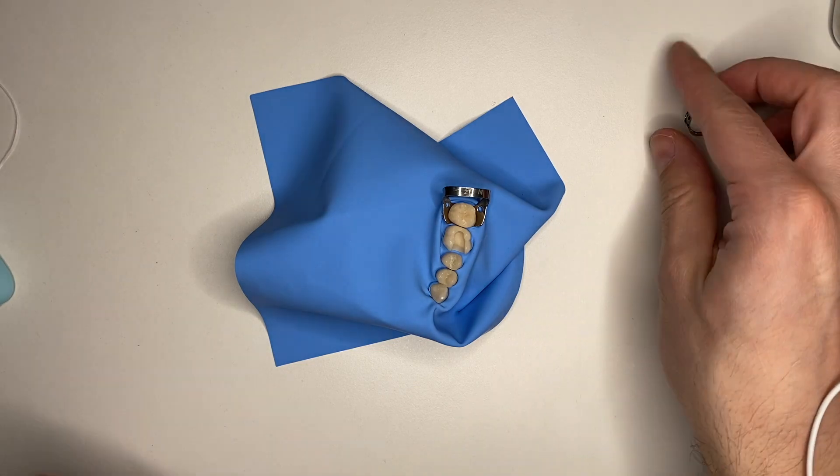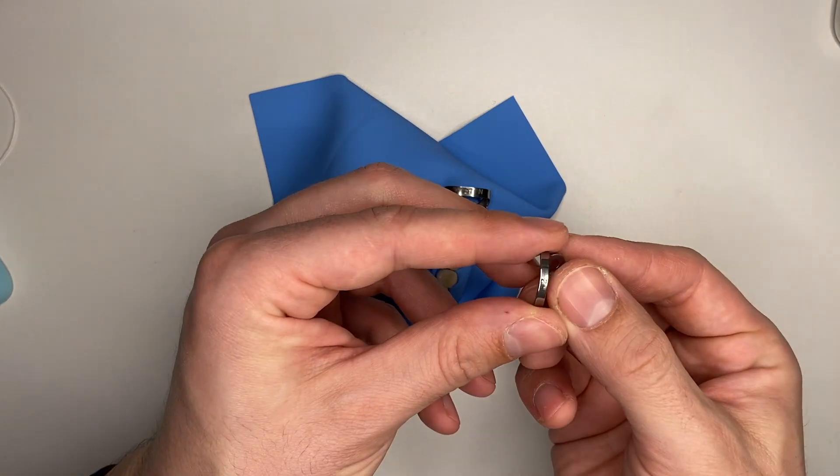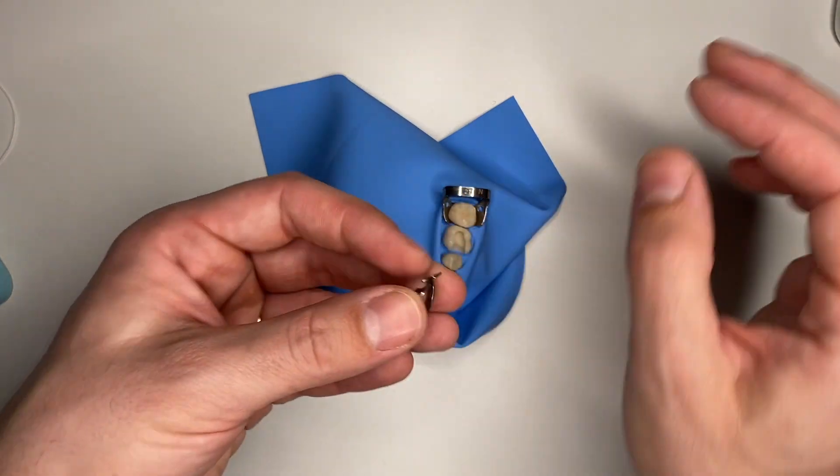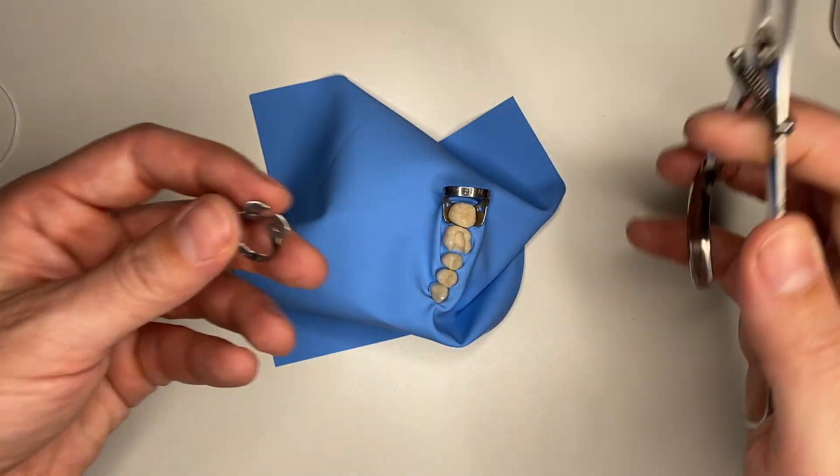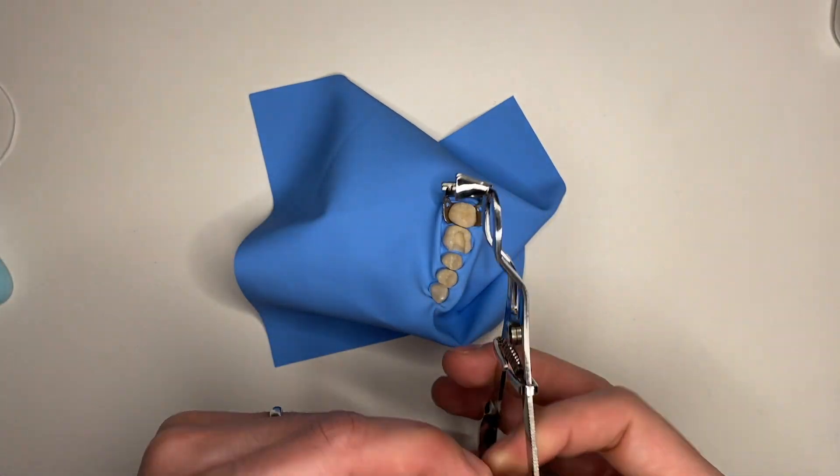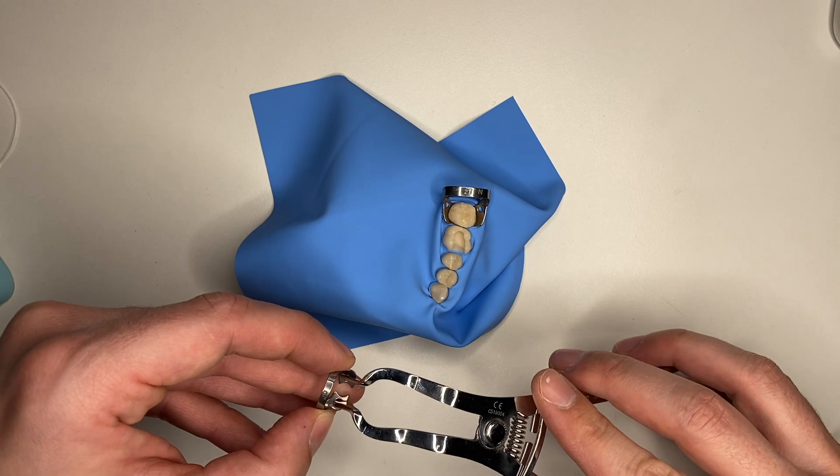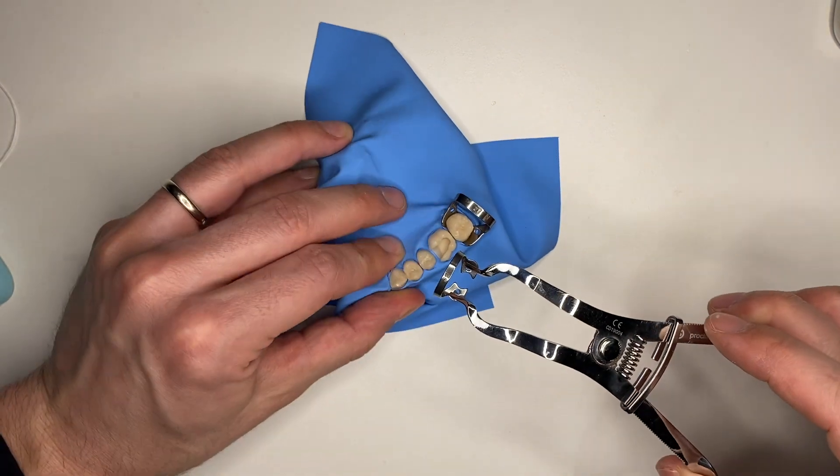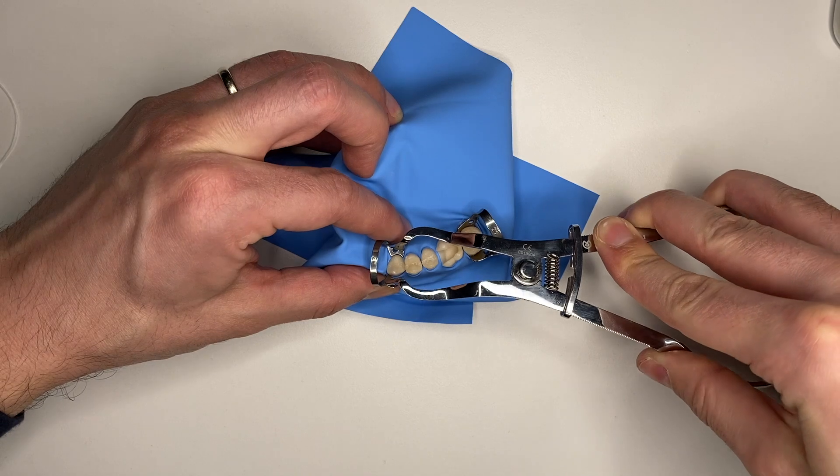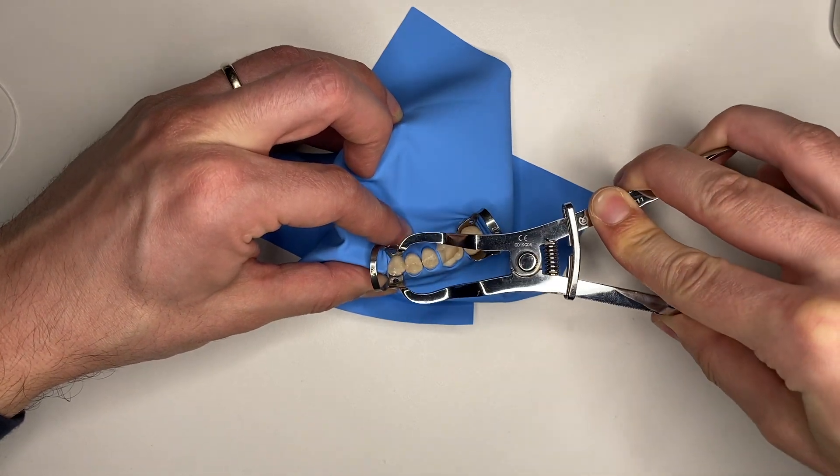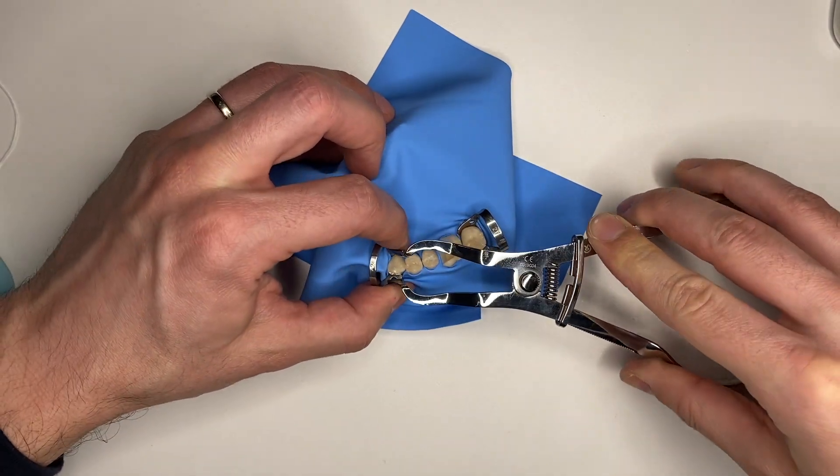Now if you'd like to, you can use a W2 rubber dam clamp in order to stabilize your rubber dam. Easily, you can put it on the canine or you can put it on the premolar, however you like.